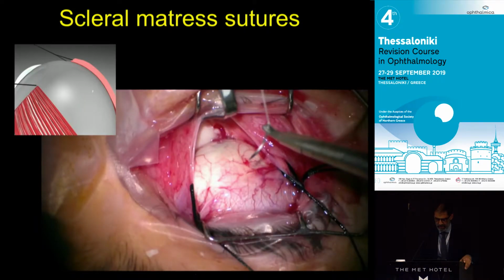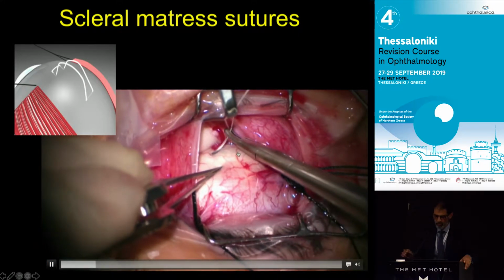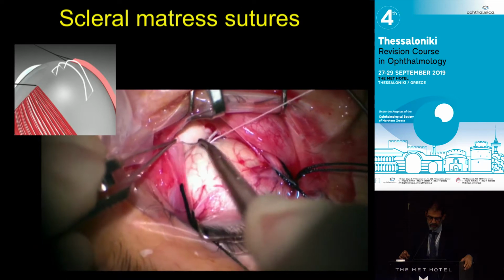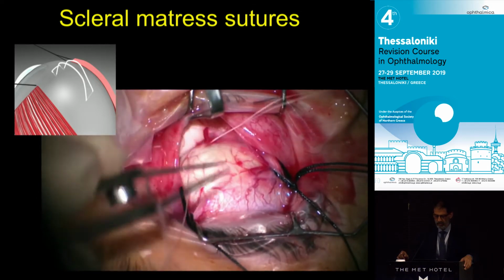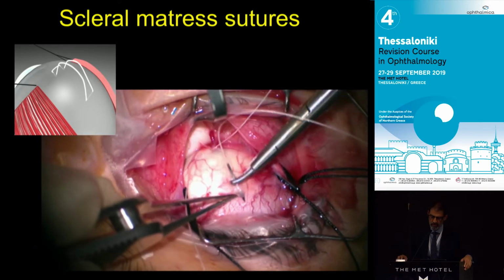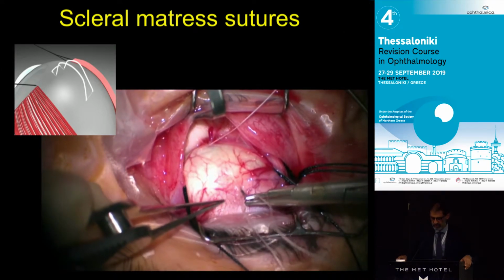The next thing is to put in the sutures. So a few things, we measure it, and then you look out for the vortex vein, which is almost always exactly where you want to put your stitch, but nonetheless, that's life. A nice deep bite there, and this is going to hold and pull the buckle in place. And a mattress suture, of course, posteriorly goes circumferentially and anteriorly goes radially, and that's to do with the disposition of the fibers. And so we put this in place here, and I usually place the sutures and then thread the buckle. And so this is just standard.